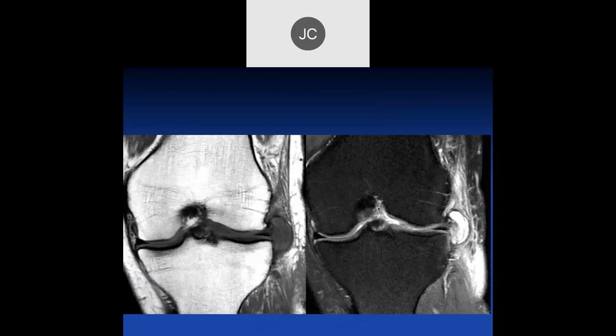All right. We have a coronal T1 and fluid sensitive fat sat of the knee. Looks like a very diminutive and macerated body of the lateral meniscus, with a nice sharp edge there. But we do see this signal intensity going across it, going to the superior articular surface. And then adjacent parameniscal cysts in the lateral, and probably some bleed, rupture of the perimeniscal cyst with some edema around it.